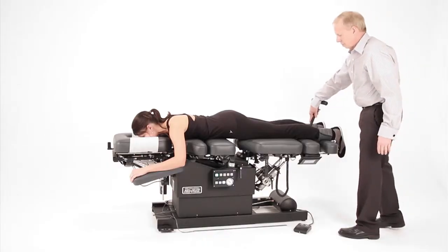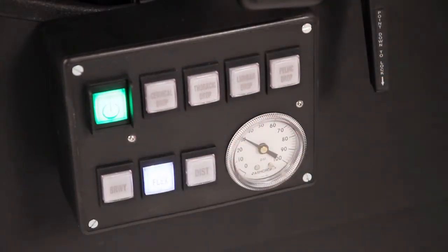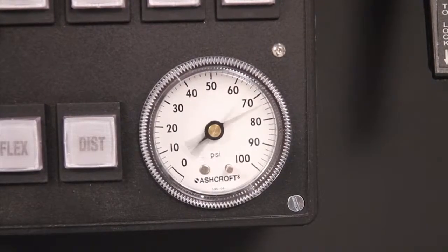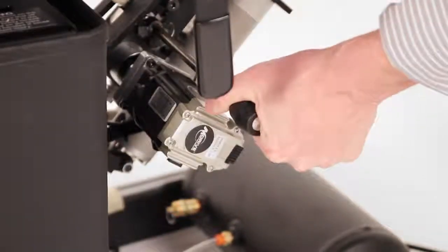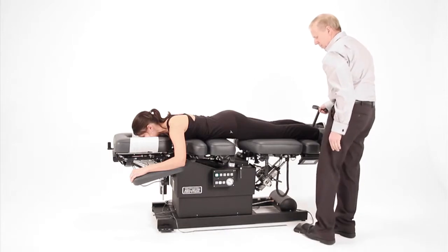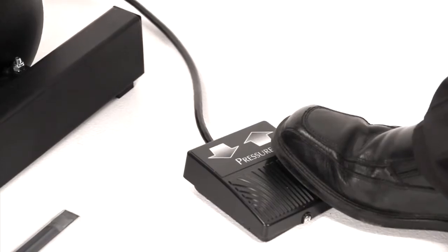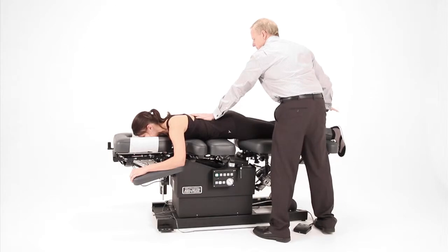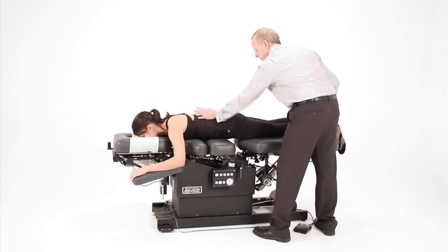With your patient in distraction, insert the tiller bar into the foot end of the table and select the flexion button. Because the AirFlex uses air to counterbalance the patient's weight, preload the flexion air pressure to about 30 to 50 psi. While holding the end of the table, disengage the flexion handle by turning it to the 3 o'clock position counterclockwise. Then, counterbalance the table to a horizontal position using the pressure pedal by increasing or decreasing the air pressure. Once the patient is perfectly counterbalanced, you can manually flex your patient with ease.